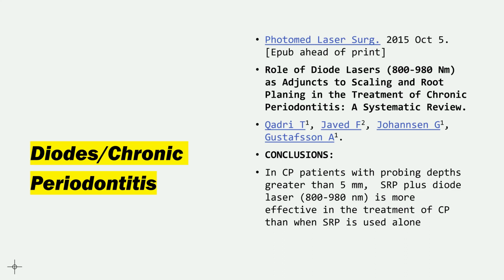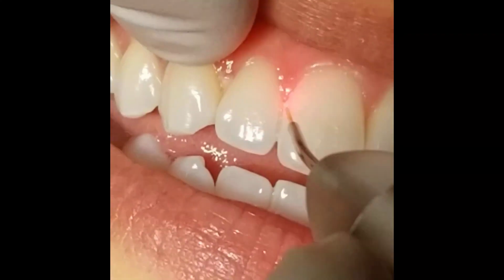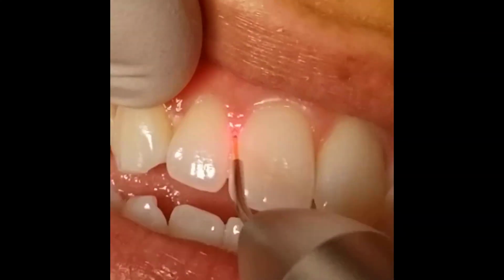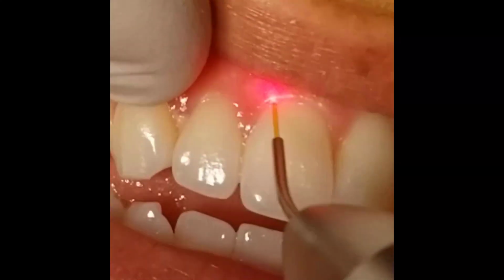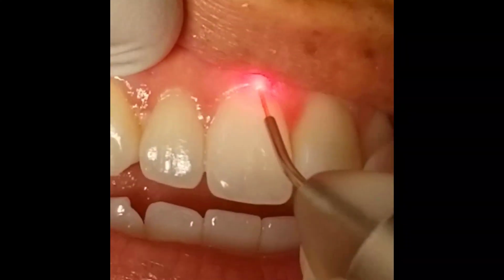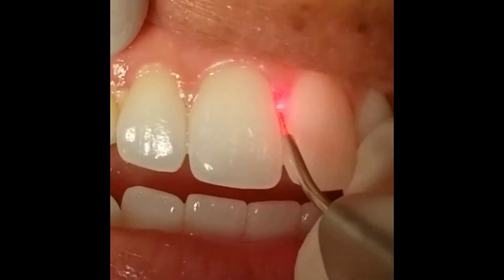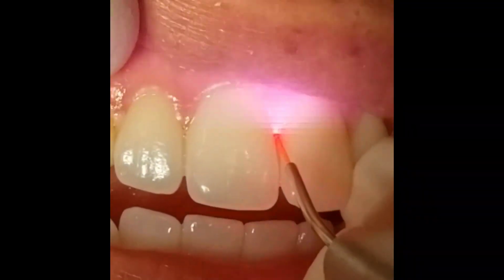Let me show you how that kind of works. This is a healthy mouth, but just to give you a demo. So 15 to 20 seconds in here. The pocket, moving around. If the pocket was 7 millimeters, we'd go in, say, going 6 millimeters. We're at 4/10 of a watt on the 810 wavelength in an uninitiated tip.